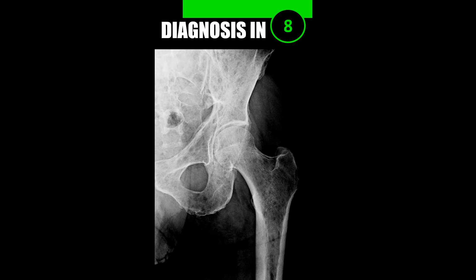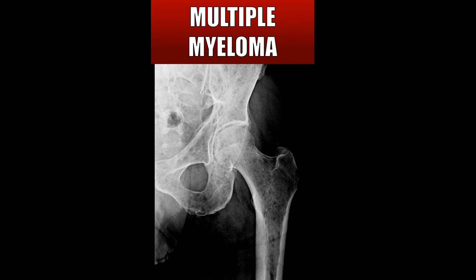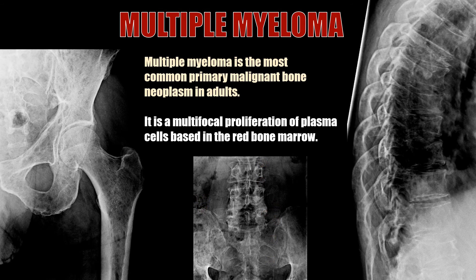Case number six: this is multiple myeloma demonstrating numerous locations of punched out lytic lesions. Multiple myeloma is the most common primary malignant bone neoplasm in adults, and in this case you can see multiple punched out lytic lesions scattered throughout the bones.